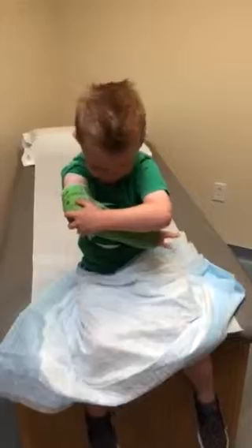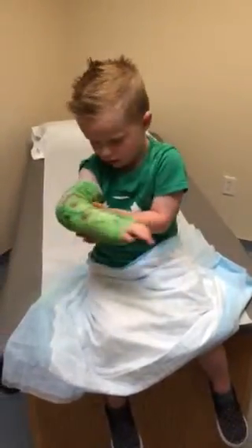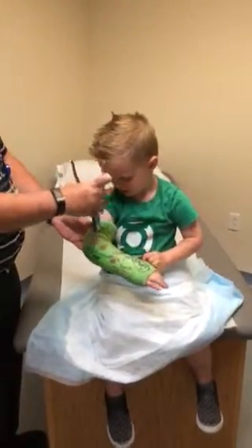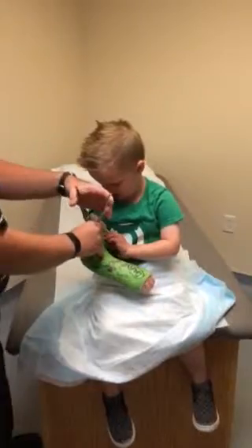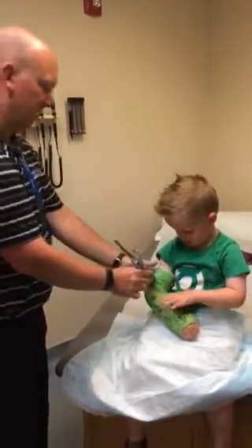I can't open this — he'll open it, I'll open it for you. You want to help me open it? We need this. We're going to put this in here. Now I want you to squeeze as hard as you can on this handle right here, squeeze those tongs up there. Can you squeeze it? I'm going down one side.